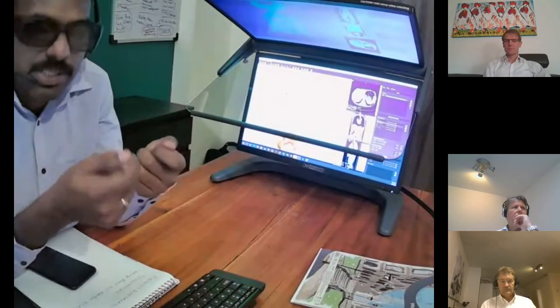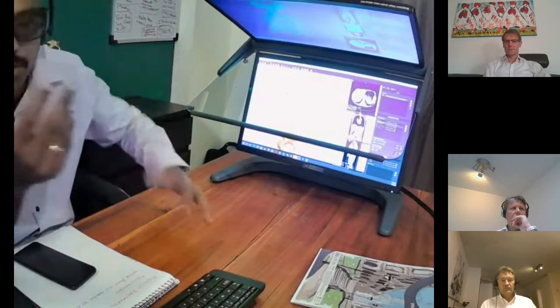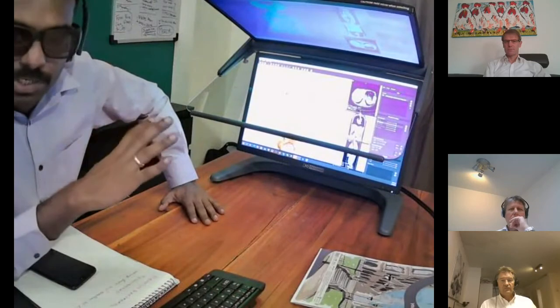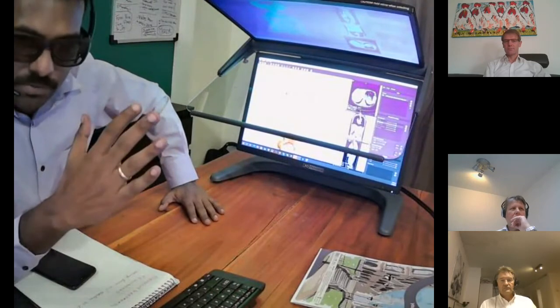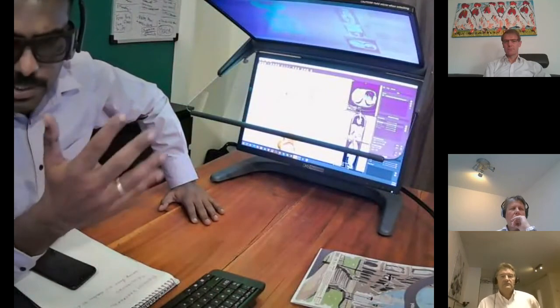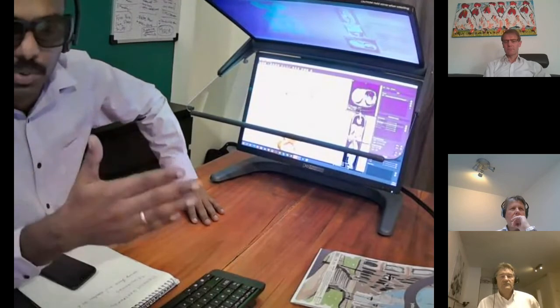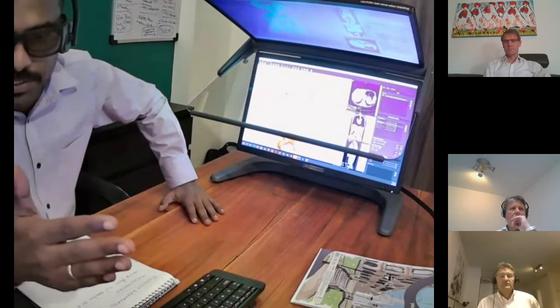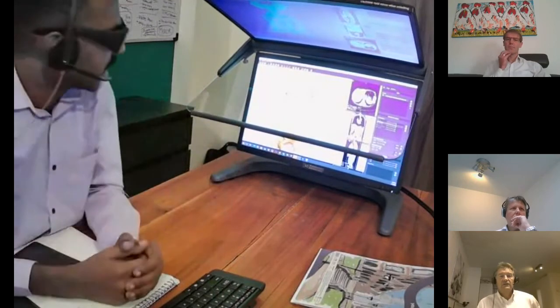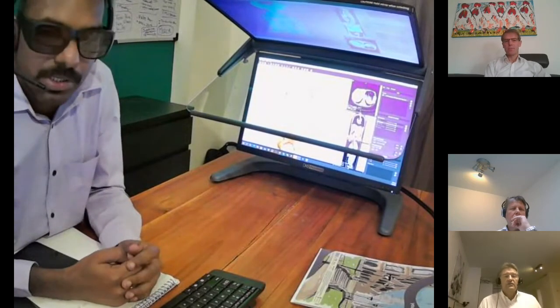active shutter glasses. This is another stereo technology where you have flickering glasses that will actually make you tired when you look for more than 45 minutes. Here we can minimize that tiredness. Still, you can work for more hours. For example, in radiology, if you are continuously getting data sets and you want to work through so many of them, you can very well see them in a normal, very smooth and very interactive stereoscopic interface.